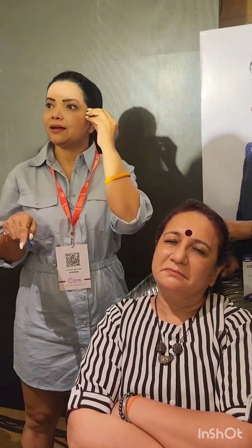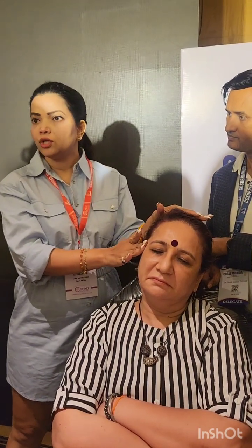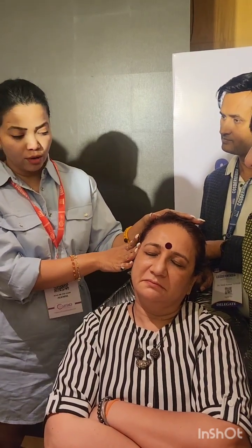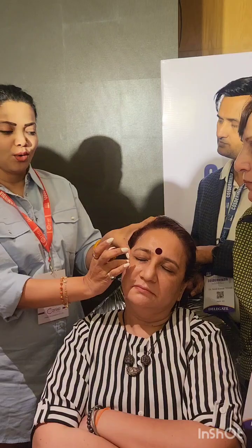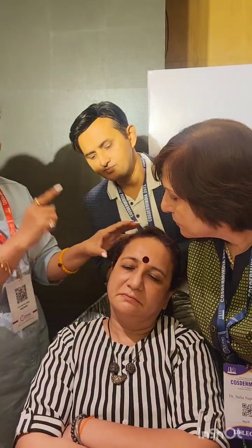And for vectors, there is an entry point and there is an exit point. Always keep 1 or 2 entry points because we introduce the maximum number of threads from that point to give it maximum strength, the force of lifting. That is called the force of lifting. So we are actually creating a maximum vector force to create maximum fibrosis and to target more area. So one entry point and maximum.